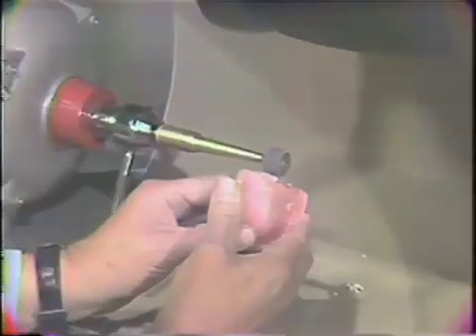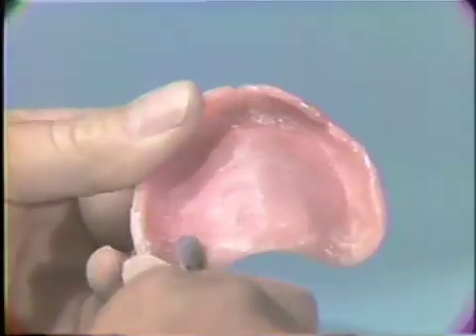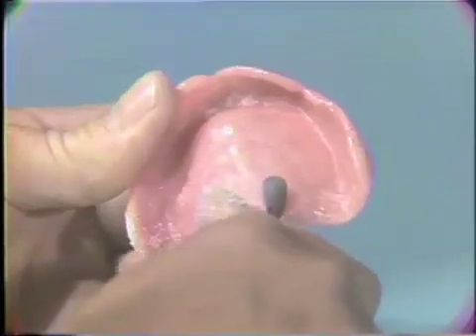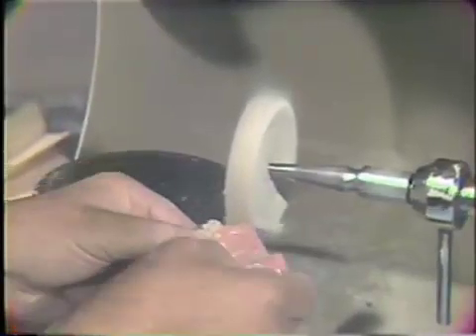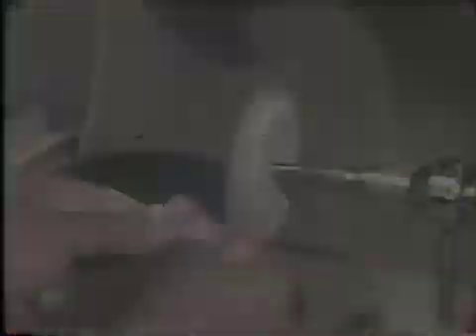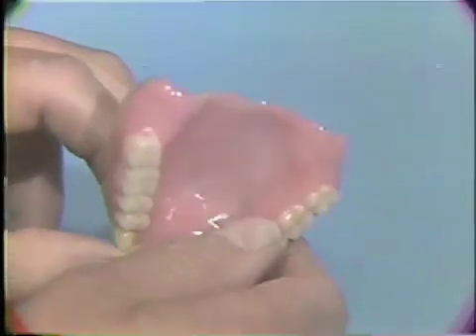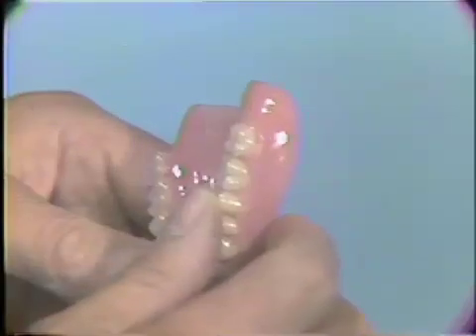Smooth and contour the repaired areas with an arbor chuck with vulcanite burrs. And then, polish with pumice. Note the repair is smooth and without sharp edges. The posterior palatal seal blends into the denture and is free from defects in the acrylic.